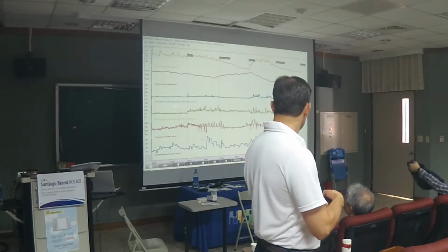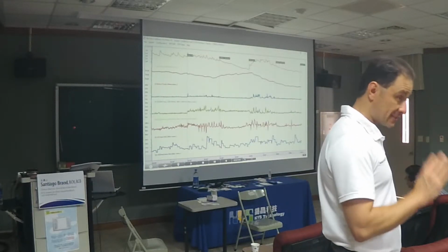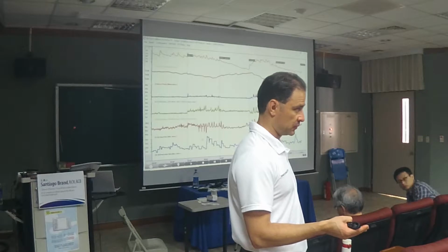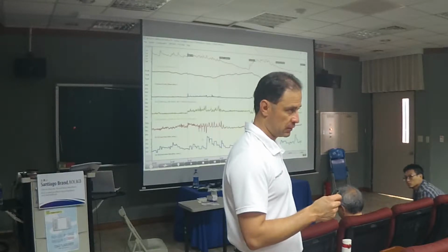Now we have the EMG. The ideal value for EMG, any muscle group, resting again, is going to be, in the literature, about 2 to 3 microvolts. Okay, so the muscle is very relaxed. 2 to 3 microvolts resting EMG for any muscle group.